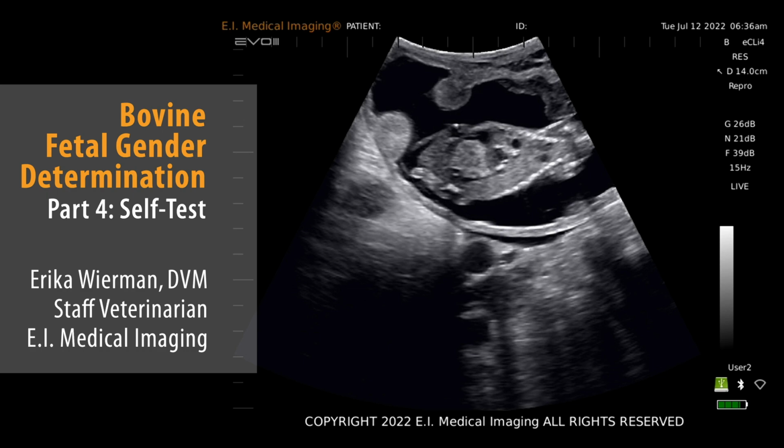Welcome to part 4 of our 4-part series on bovine fetal gender determination. This installment features a self-test that will allow you to check up on how much you've learned from the previous 3.